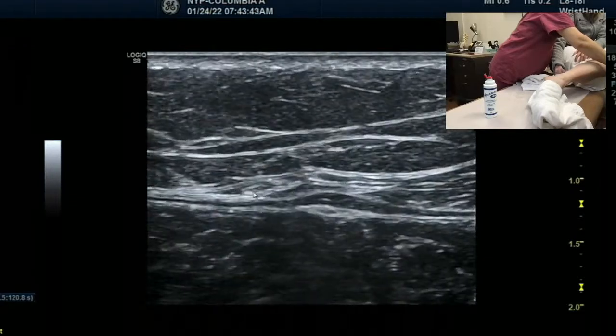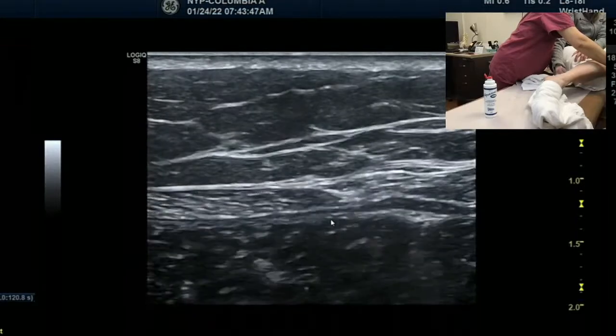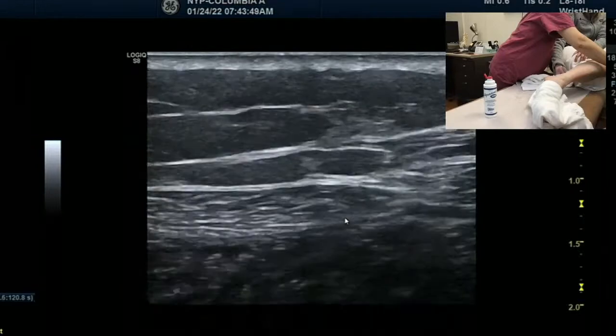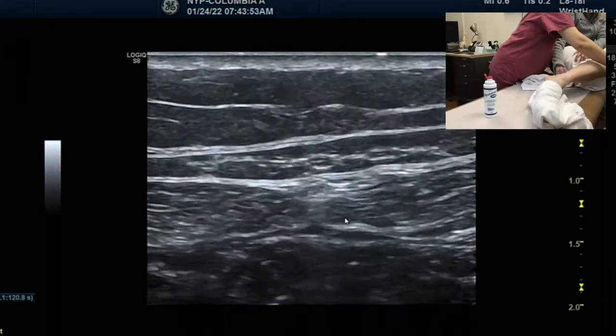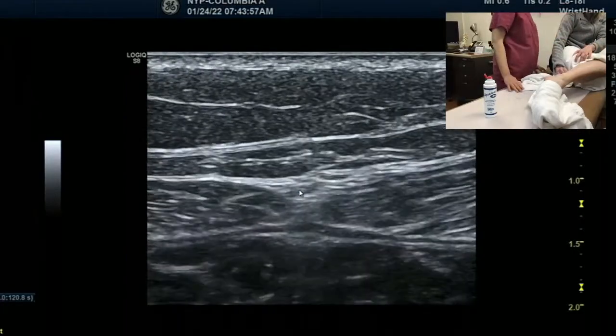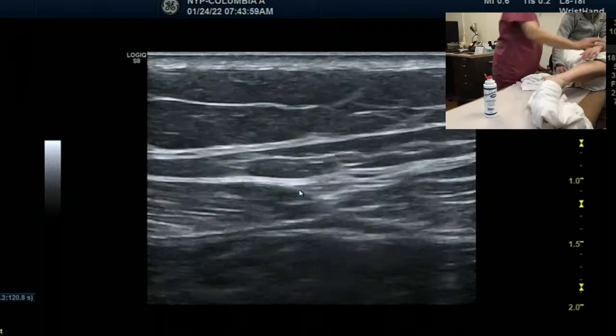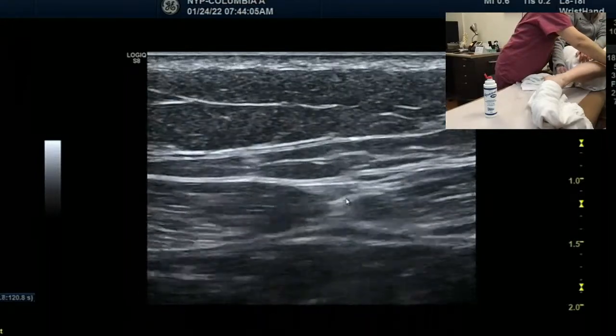So here, and scan up. Here, it's going to split. Here. So, what's this? I think they're now splitting. Here, up and down, that area. Getting a little stuck on the cord.